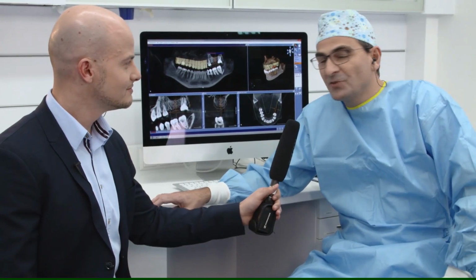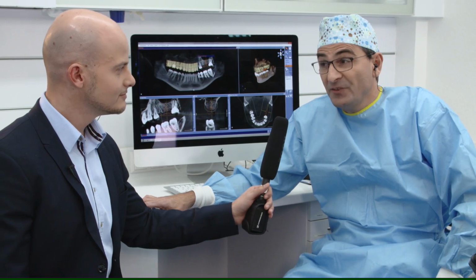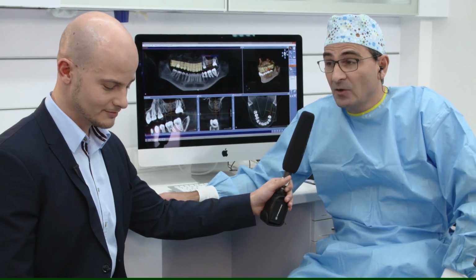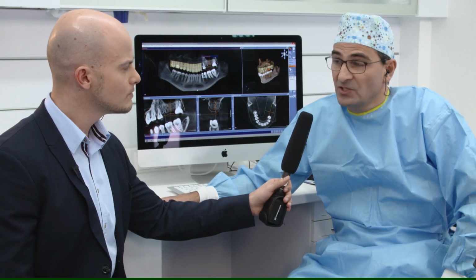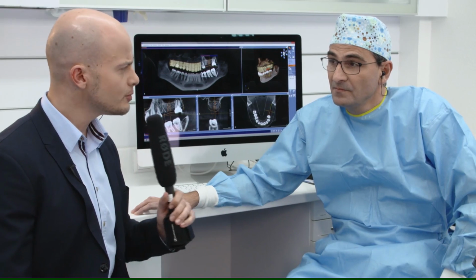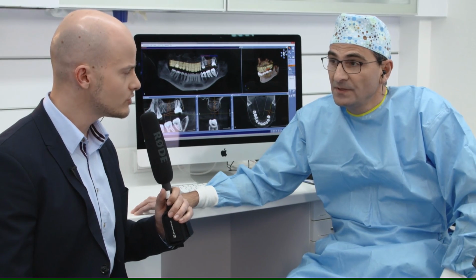Hello Frank, thank you for your introduction. The case is a 34-year-old lady, and she had some problems with her endodontically treated teeth, and they have to be extracted. This was done at another practice, and they also performed a socket preservation in this case. Okay, and how did you prepare for this surgery?